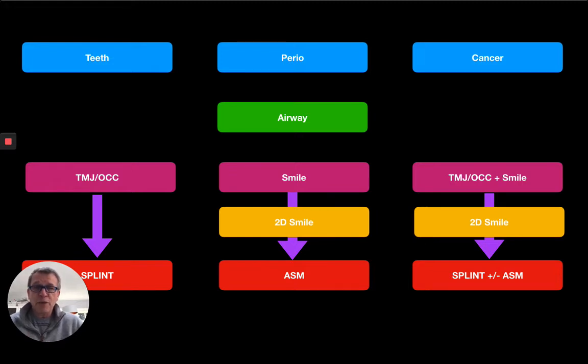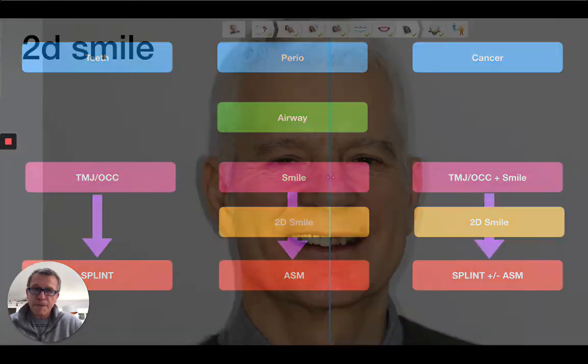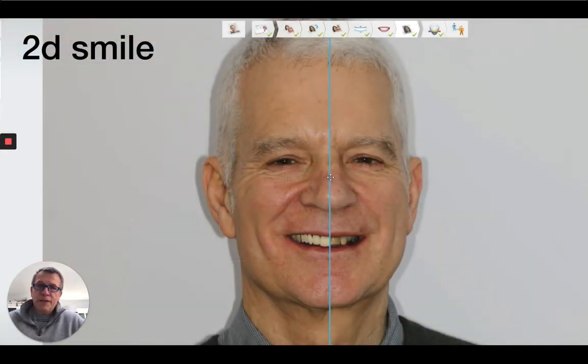Ideally, if they don't have those things, we can press on. That's my favorite patient. I just have to make sure that I don't do anything that would make them more likely to develop any of those situations. So one of the things that we want to talk about with Ray is, what might this look like for you? And this is what is so cool about digital these days.